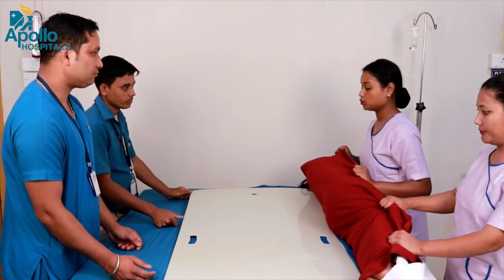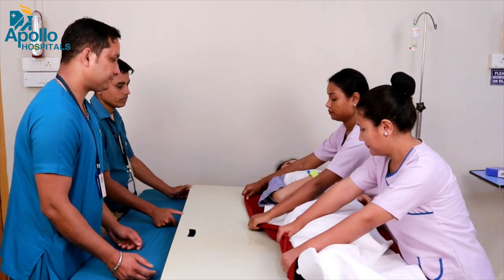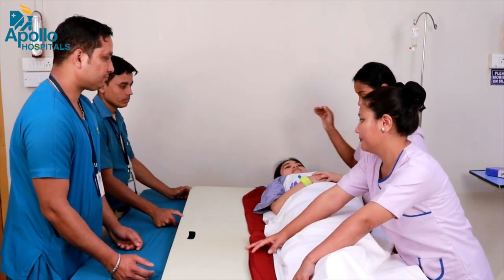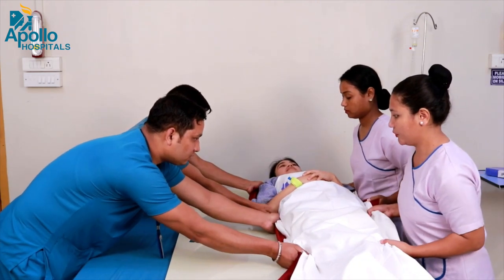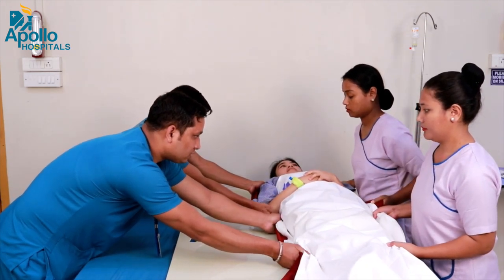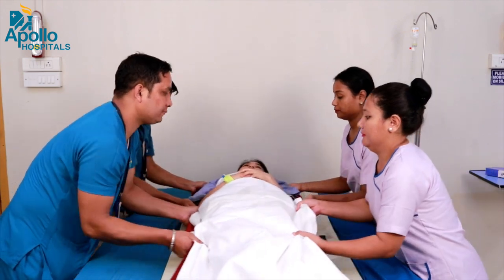Now gently roll the patient back onto the slide board. One, two, three. Position the weight of the patient. On the count of three, pull back the patient. One, two, three.